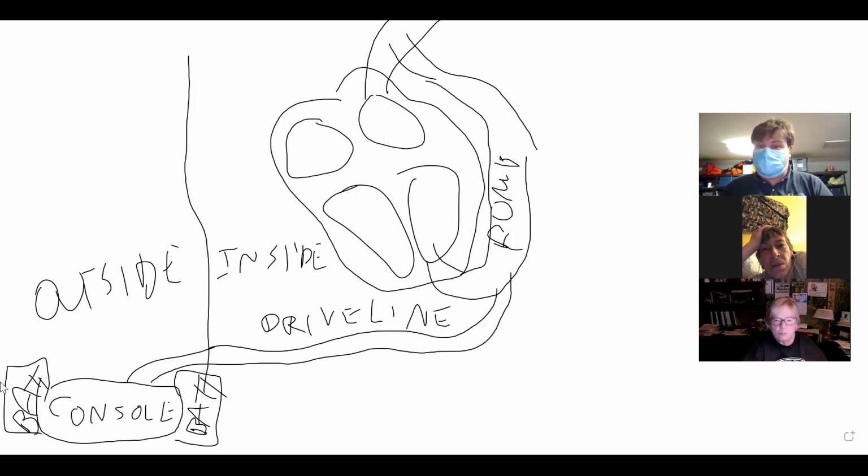And then there are some patients where the ventricular assist device is doing most of the work, and pulling out both batteries at the same time basically puts them in cardiac arrest. So if you have to help a person change their batteries, or you come across an unresponsive person and you're changing their batteries for them, you need to change the batteries one at a time. And as we talk about problems that we might see in EMS with ventricular assist devices, the first thing that you want to start with is the batteries if the console is not telling you anything about what is wrong.